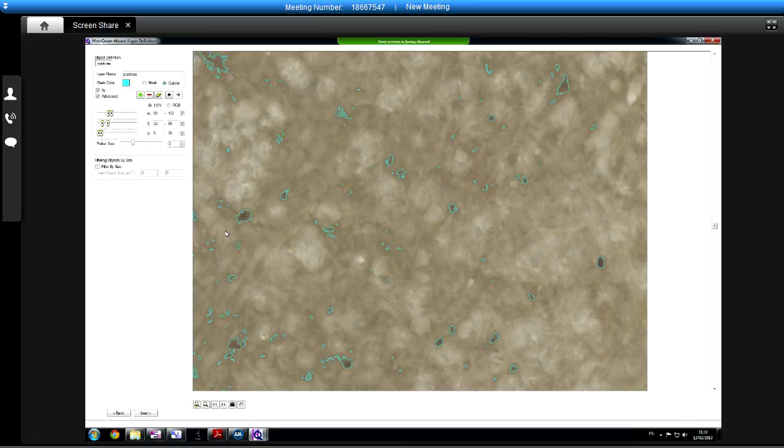What would you do if you were following this manually? What would you do now? I'd probably leave it. Would you dial the focus on the microscope? Or would you just leave it? I'd play through the mic, yeah. Yeah, okay. Rather than doing it on the microscope, yeah. Okay, but that would be a yes, I guess. Yeah.